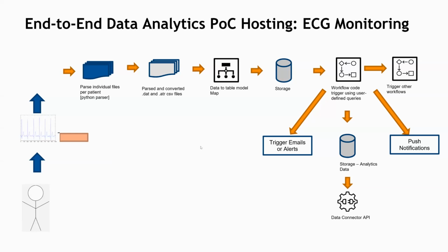gets the schema of the file, models it, ingests, explores the data, and analyzes using ECG and statistics, creates machine learning models, maybe retrains the models, and uses the existing models to detect a certain possibility of abnormal beats where files do not have such annotation. And in the end, provide all of it as an automation so that it can be updated to your client dashboard, trigger emails and notifications, another connector.